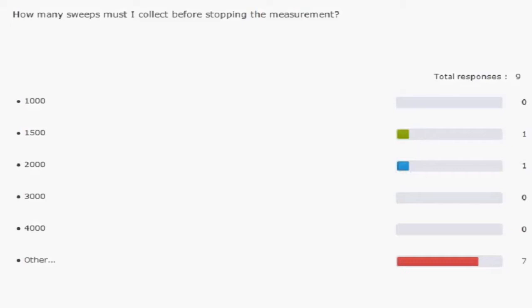I have a second question, but before I go there, let me just say, when I learned ABR at the beginning of the year 2000, 2001, I was taught to always measure 2,000 samples. So I would have expected many people clicking on the 2000 answer. Today that answer is not necessarily the correct answer, but I'll get back to that later.